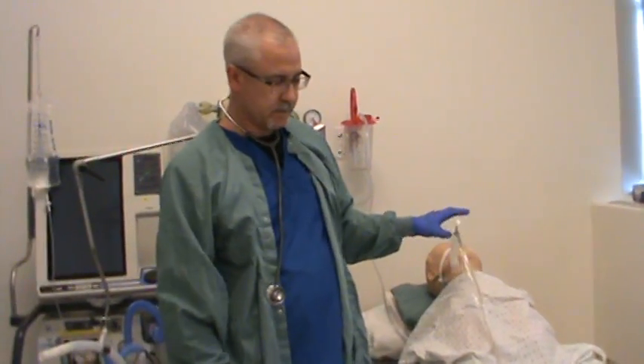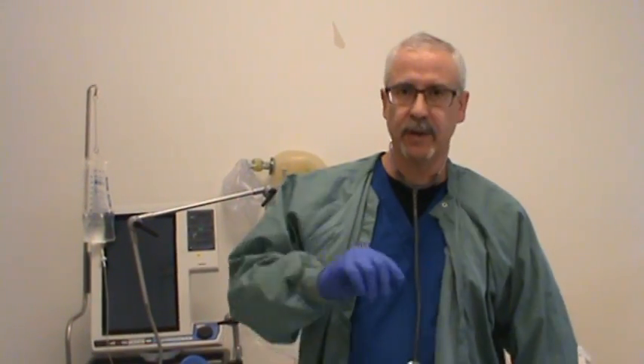That's closed suctioning. Clean up, remove your dirty attire, then chart what you did, what you found, how your patient reacted, and how you left your patient after suctioning. Make sure your patient is on the exact same ventilation parameters after suctioning as they were before.